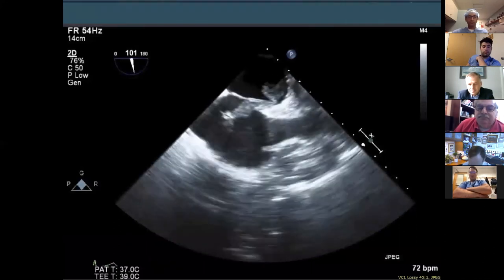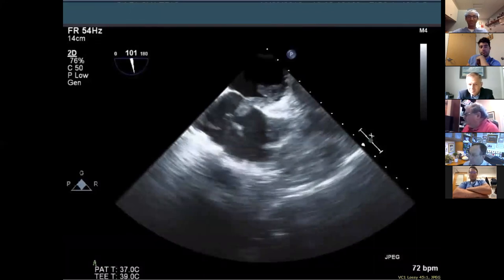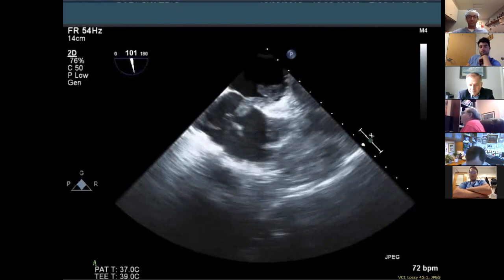For Impella positioning, the view to ask for is the mid-esophageal long axis view — also called the aortic long axis view. From this view you can measure how deep the Impella is from the annulus, which is what the Impella reps ask us to measure. This is the same view used when looking at endocarditis of the aortic valve affecting the aortomitral curtain.